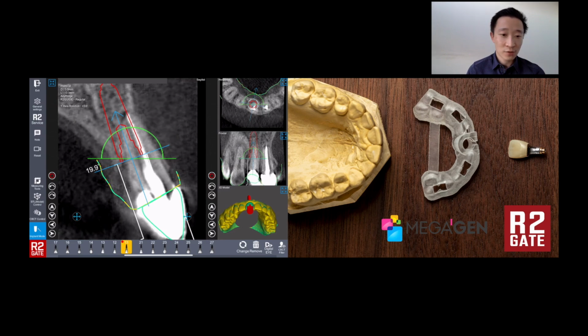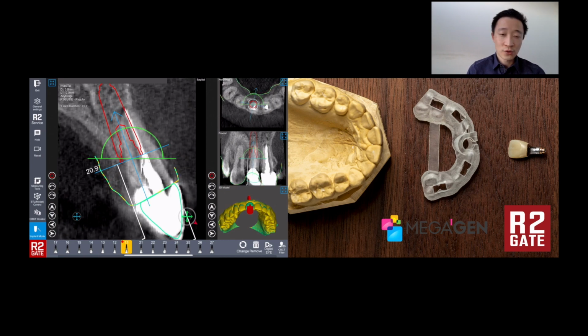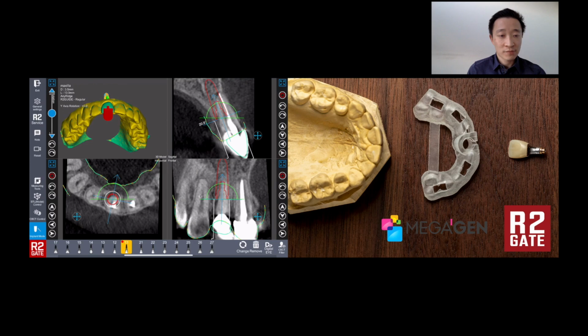On your iPad you can use your finger or the Apple Pencil to change any parameter that you would like. You can move the implant around, you can change the depth, you can change the size of the implant. There are many things that you can do here, and the beauty of it is that you can do this on your own time, and when you are ready you send it back to the planning center and you can confirm it and finalize the treatment plan with them.